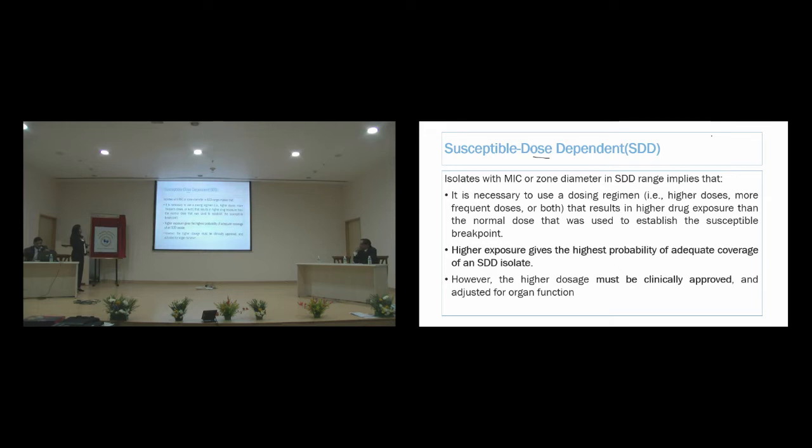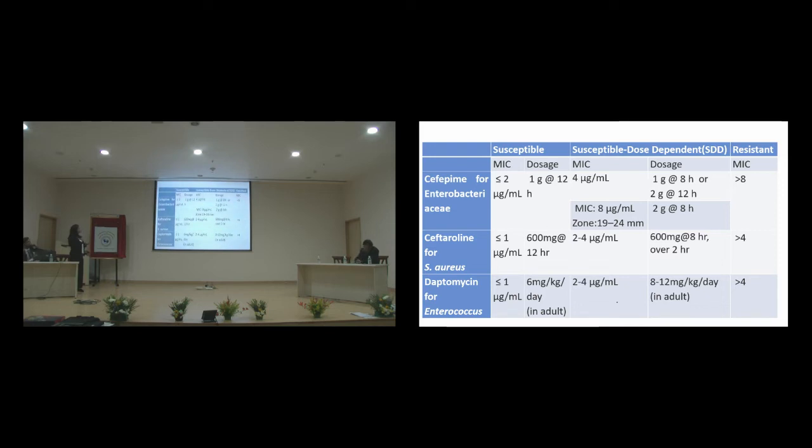An isolate with an MIC or zone diameter in the SDD range implies that it is necessary to use a dosing regimen that is a higher dose, more frequent dose or both, that results in higher drug exposure than the normal dose that was used to establish the susceptible breakpoint. Higher exposure gives a higher probability of adequate coverage of an SDD isolate. However, higher dosage must be clinically approved and adjusted for organ function. This should be kept in mind. So these are the conditions where SDD is available in CLSI 2019: cefepime for Enterobacteriaceae, ceftaroline for Staph aureus, daptomycin for Enterococcus.